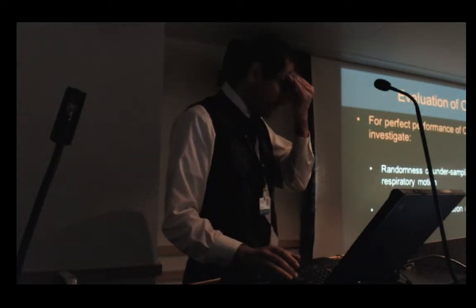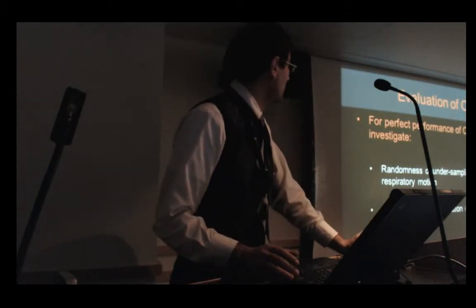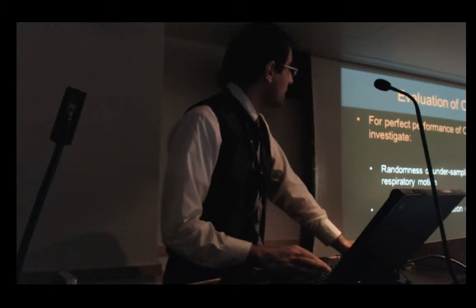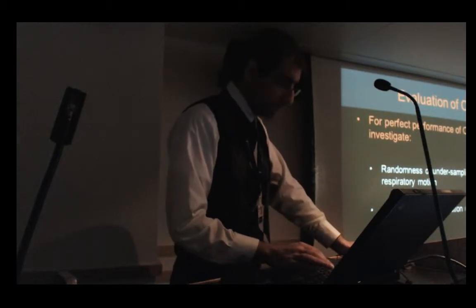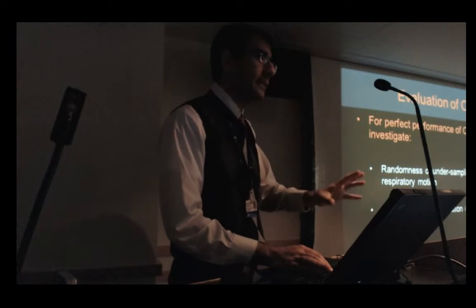You can appreciate the image quality is comparable to the prospectively gated one, but the image acquisition time is half. So we can save imaging time. But the time it takes to reconstruct these images using the CS algorithm is about 2 hours.